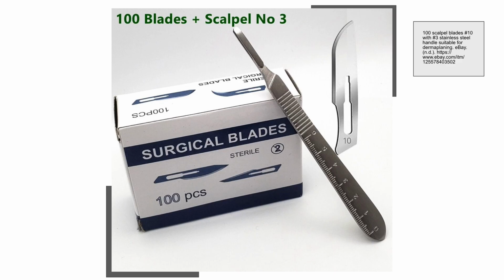Step 1. Making the incision. To begin the surgery, the surgeon will use a 10 blade to make a large incision in the patient's abdomen. Once the incision is made, the surgeon will use cautery, Metzenbaum scissors, and a variety of pickups to dissect down to the bowel.